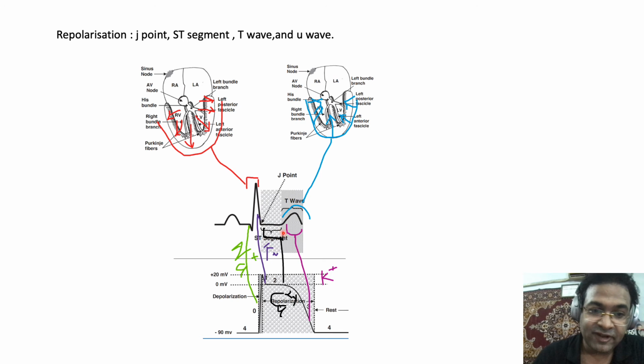And everything to do with potassium is related to T wave. It's very well known. So T wave, potassium is responsible for T wave. So if there is hyperkalemia, there are peaked T waves. If there is hypokalemia, the T waves become much more flattened. So this is in a nutshell the way to understand how electrolytes and some antiarrhythmic agents cause abnormalities in the ECG.